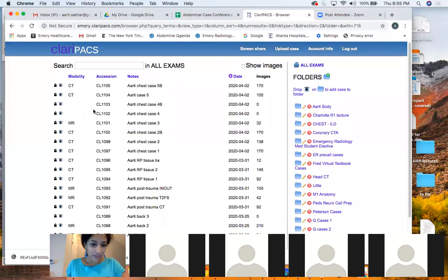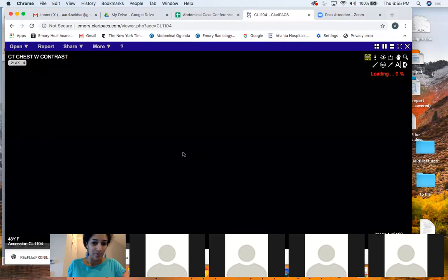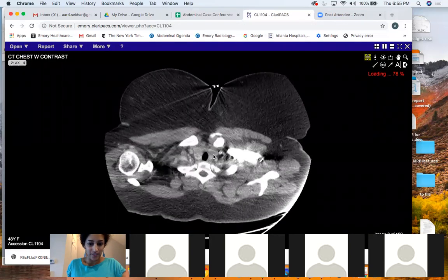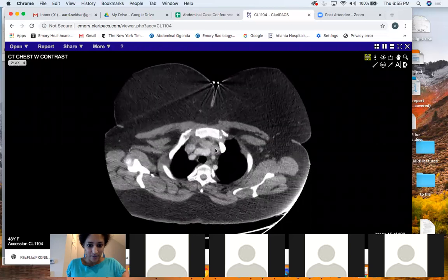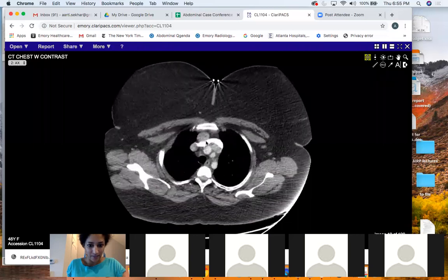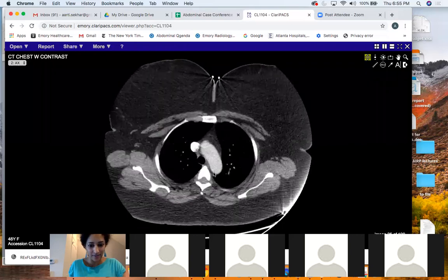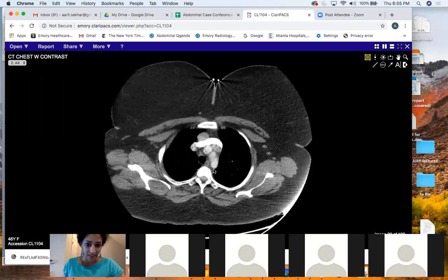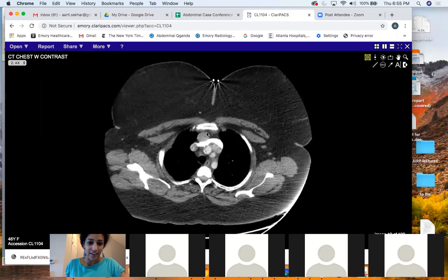Okay, my 3rd companion case is this one. This patient, you can see, had some masses in their upper mediastinum, and then this mass anterior to a brachiocephalic vein. And we thought this was basically lymphadenopathy. We were concerned about a head and neck cancer and decided that we wanted to biopsy this. We were kind of wondering, how are we going to biopsy this?